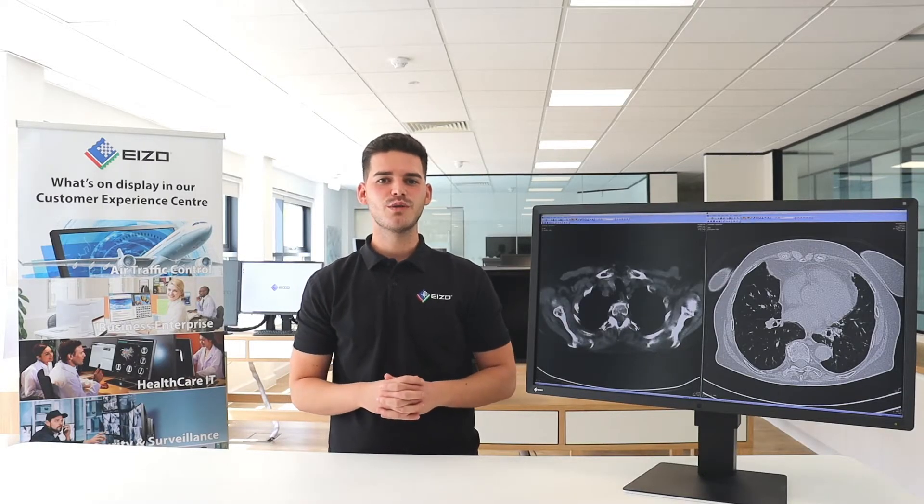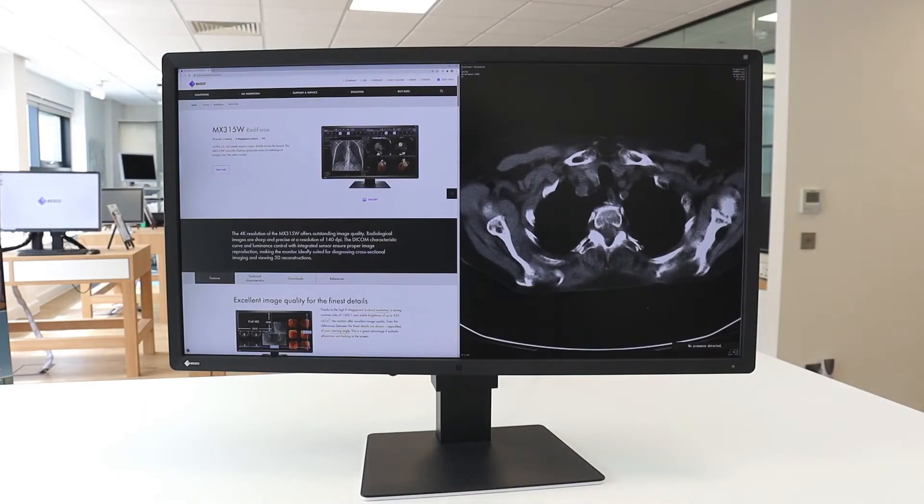Along with the already low typical power consumption figure, the MX315 is also equipped with a presence sensor that can be seen located on the front bezel. The sensor registers whether someone is sitting in front of the screen or not. As soon as that person leaves the workstation, the monitor turns off, and when the person returns, it turns back on without the need of touching the mouse or keyboard.